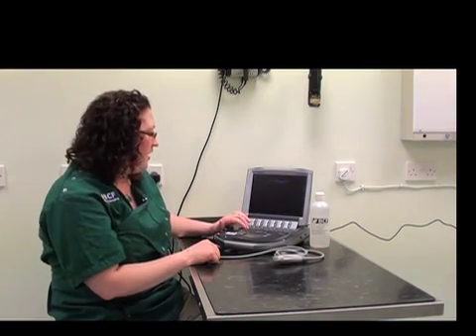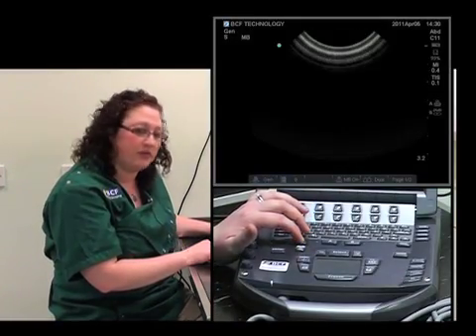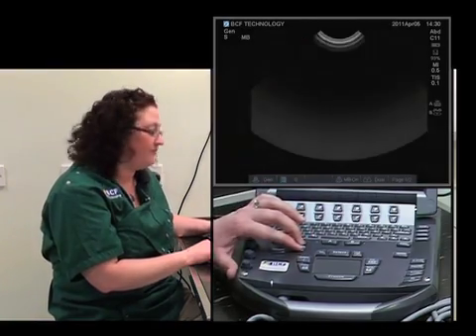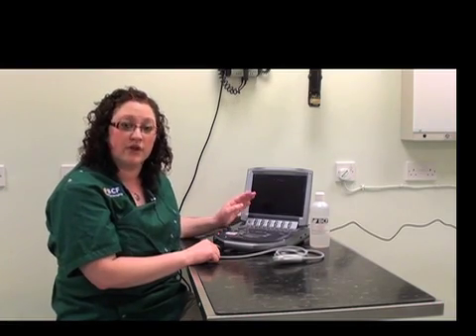Some other buttons helpful to know are the depth button. On this machine, it's located right in the center, and we can decrease or increase the depth. It's important to know where this is because the depth will change throughout the ultrasound examination. It's usually a good idea to have the organ of interest occupying about three quarters of the screen at any one time.